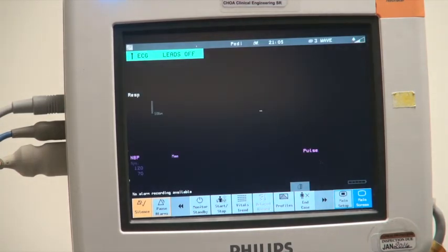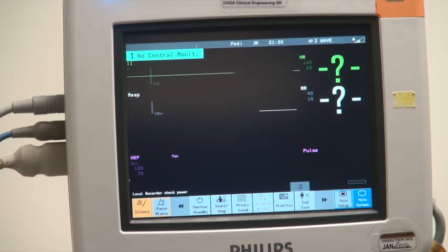Let me see what else you would need to do. There is the end case. Do I use that one? The end case? No, not really.